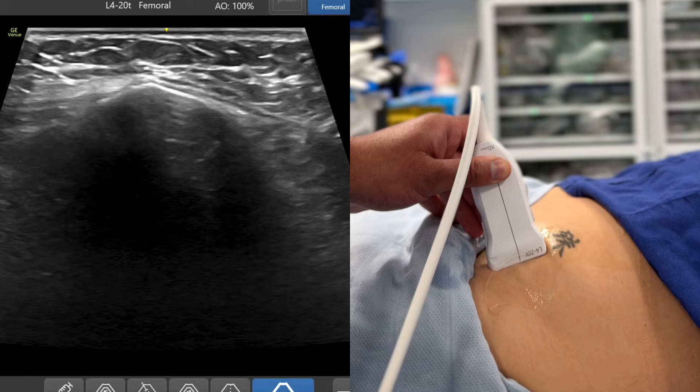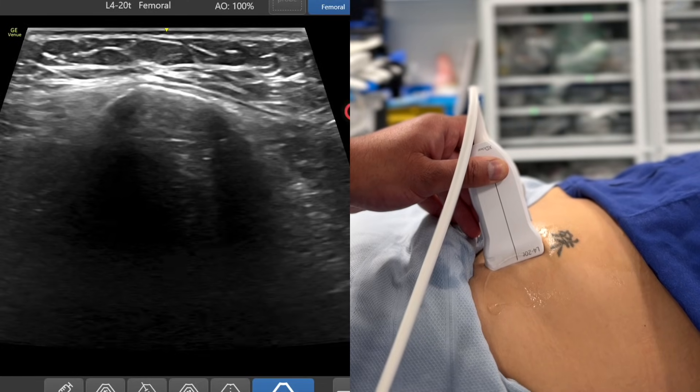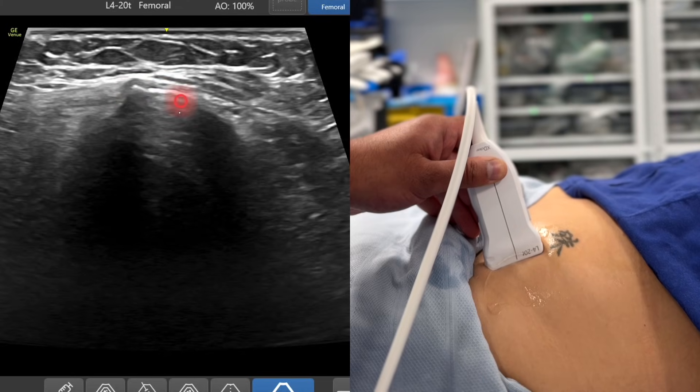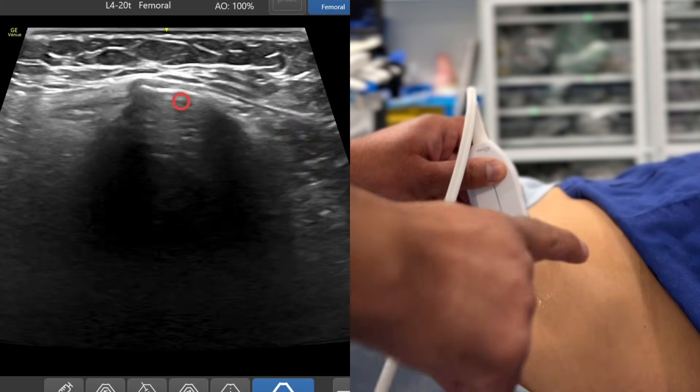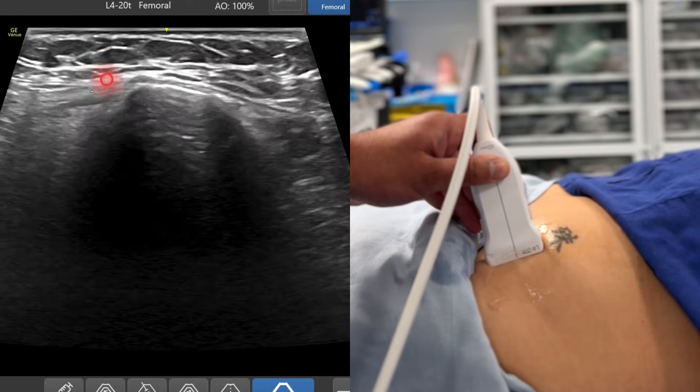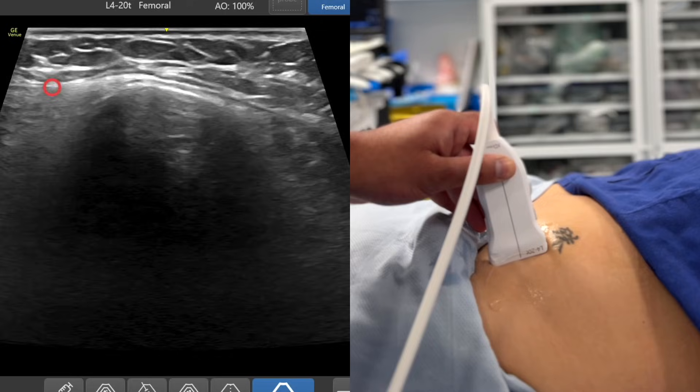You can see that bright white structure showing up. I'm not going to put too much pressure on here because it feels uncomfortable to be scanning over bone, but there's the anterior superior iliac spine. This is cephalad on the right hand side of the screen — you'll see that as cephalad. The left hand side of the screen is caudad.